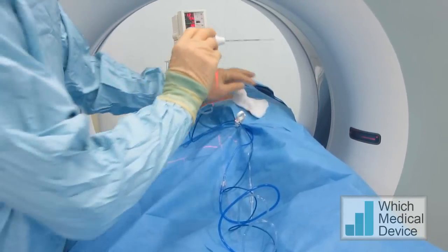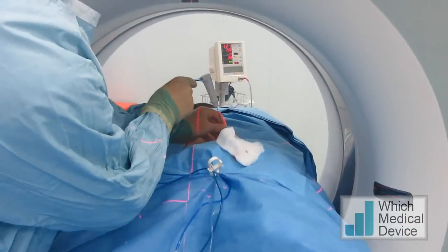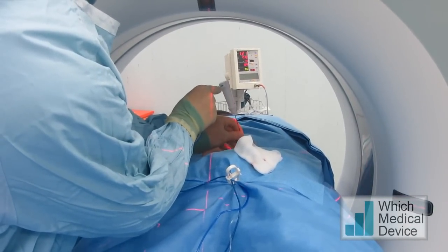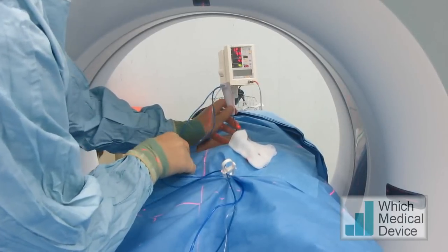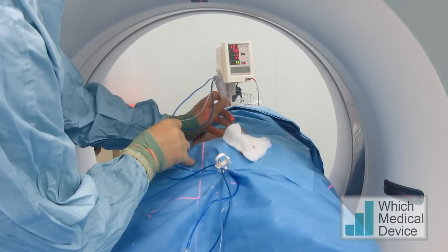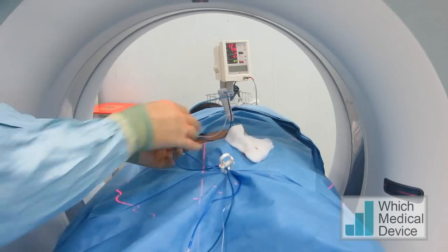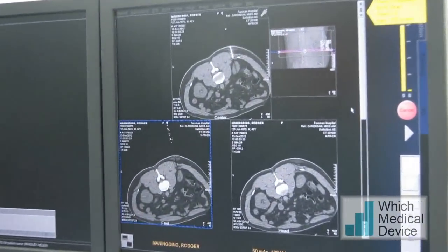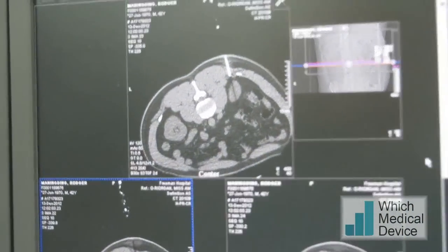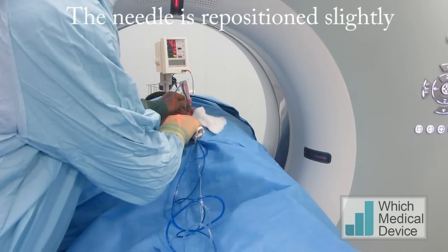We're just going to position the needle now into the lesion. Take a breath in for me — hold it there — and breathe away. Breathe away.